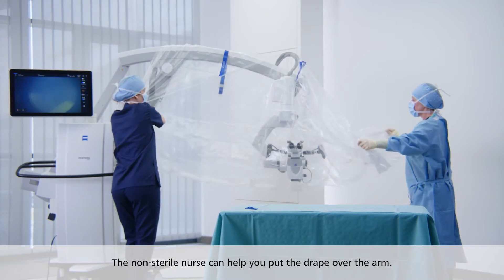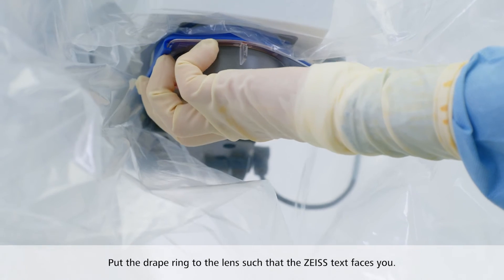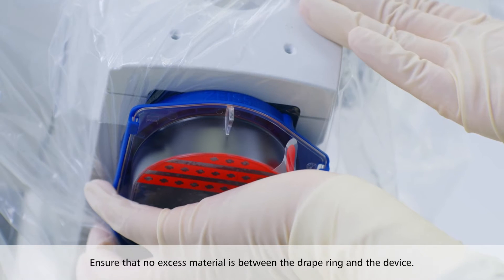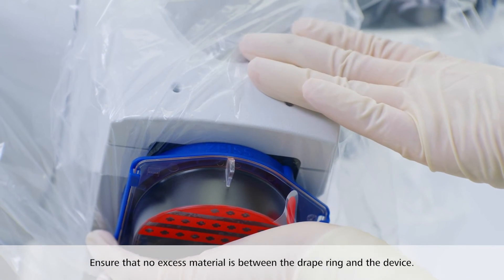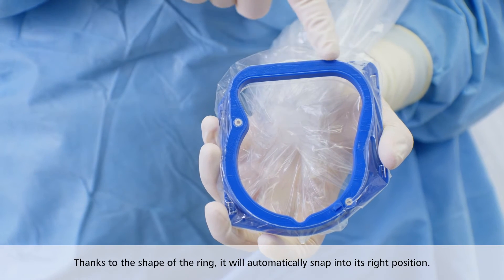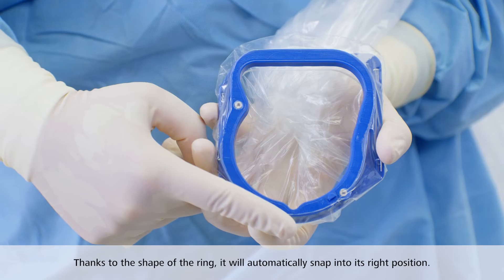Cover the head of the device. Put the drape ring to the lens so that the Zeiss text faces you. Ensure that no excess material is between the drape ring and the device. Thanks to the asymmetric shape of the drape ring, it will automatically snap into its right position.